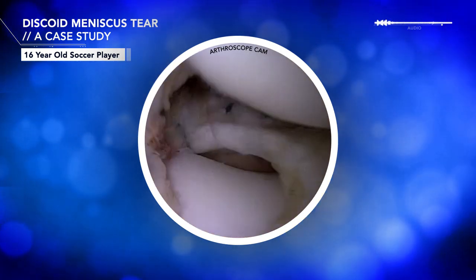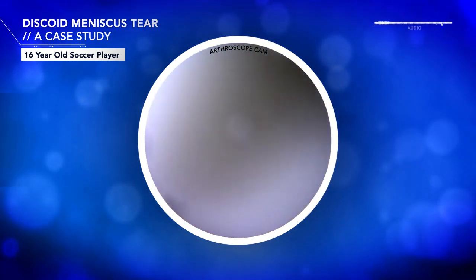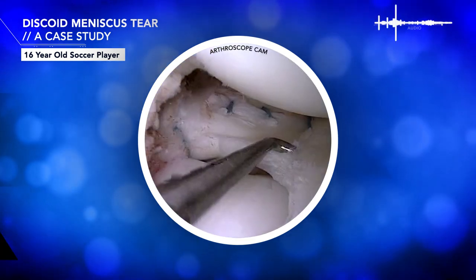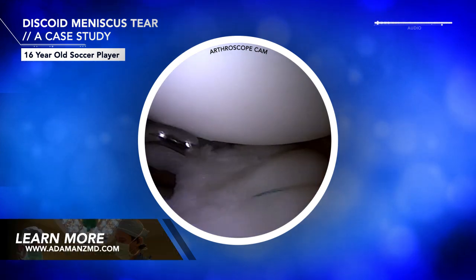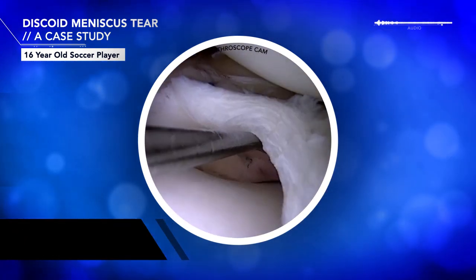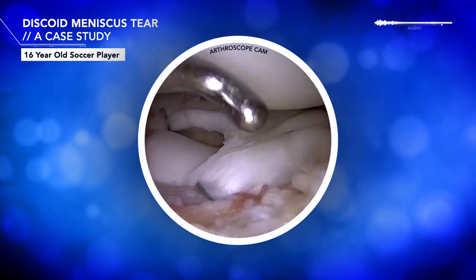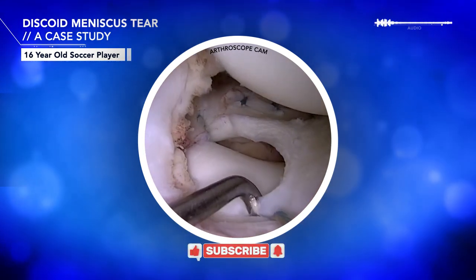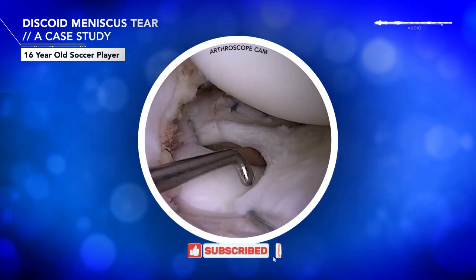So our first order of business is to suture the meniscus back into its normal position. We use both sutures in an all-inside fashion as well as an outside-in fashion. And this places the meniscus back into its normal position. And this allows for us to both put it into its normal position, but also saucerize it and take away some of the abnormal thick tissue and the abnormal coverage to make it more like a normal lateral meniscus. We've used mini sutures in this case because we want a very strong construct so they'll remain in place while it heals.